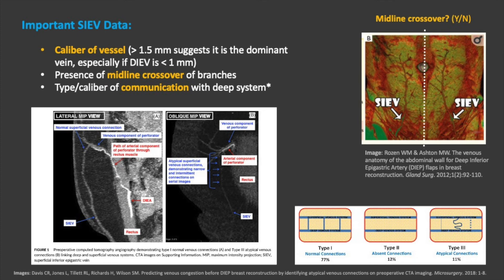The image on the left demonstrates the location of the communication between the SIEV and the DIEV. The classification of venous connections is helpful in risk-stratifying patients. A type 1 venous connection is normal with a straight course between the deep and superficial systems; these patients are good candidates for deep flaps. In type 2, the connections are absent; these patients can still be good candidates if the deep venous system is dominant, as suggested by a large-caliber deep inferior epigastric vein. A type 3 connection is atypical or has an indirect, tortuous course between the superficial and deep systems; these patients are at increased risk of venous congestion and may need supplementary venous anastomosis in the operating room.